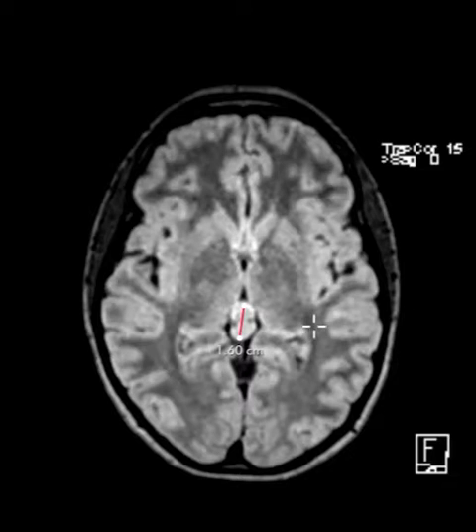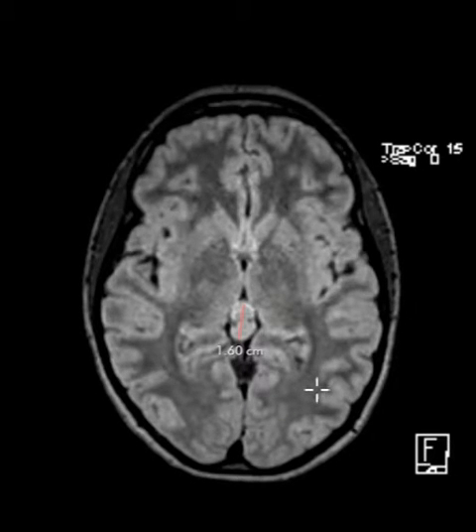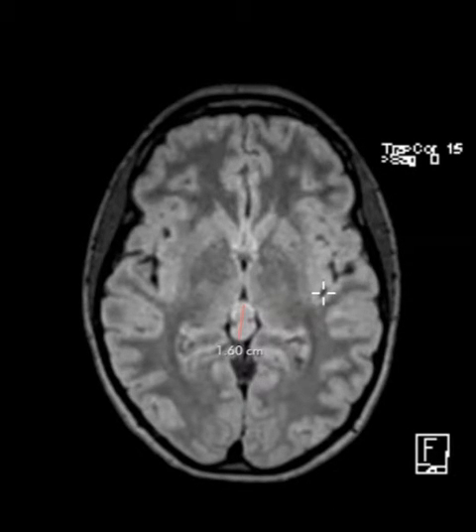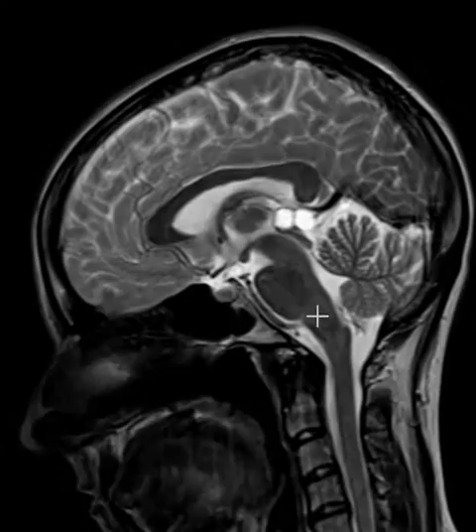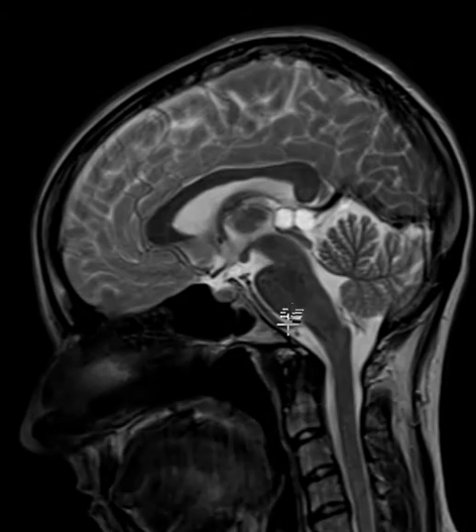So we've learned to not need to do follow-up on these because they're usually stable when they're small and don't cause any trouble. But if they're over 1 centimeter, or some people say 1.2 centimeters, then it can be difficult to tell if it's just a benign cyst or if it's a cystic tumor like a pinealocytoma that can look identical, and the cystic tumor can grow over time and cause trouble. And so if it's big like this one, or over 1.2 centimeters, it may be wise to follow these just to make sure they don't grow.